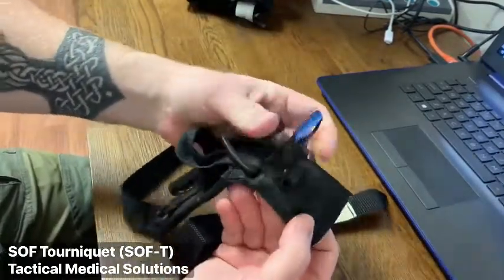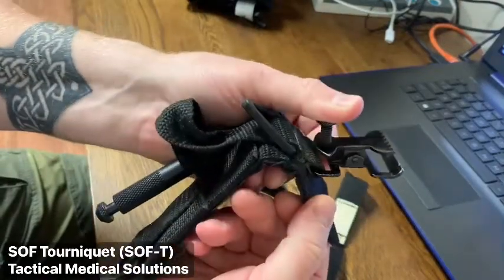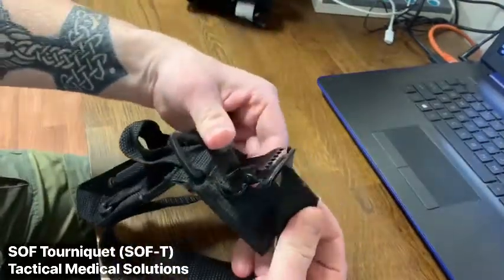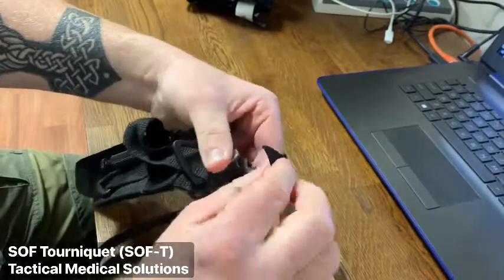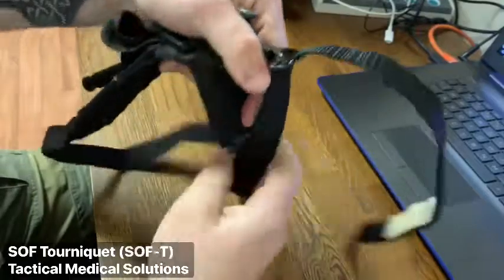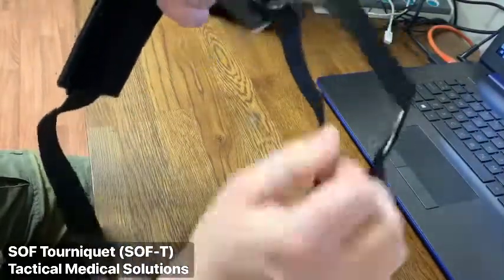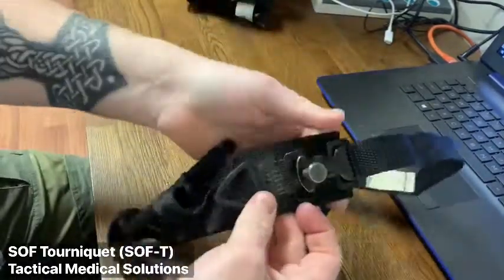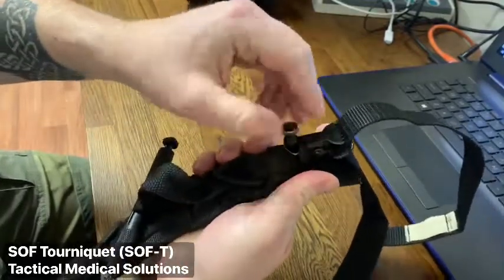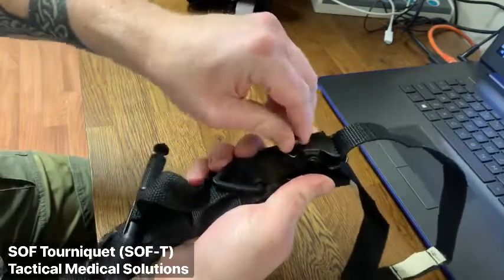This tourniquet utilizes a spring-assisted clamp buckle to feed the band through. Once you feed the band through the buckle sufficiently, ensure that you rotate the retention screw down to prevent the clamp from loosening.